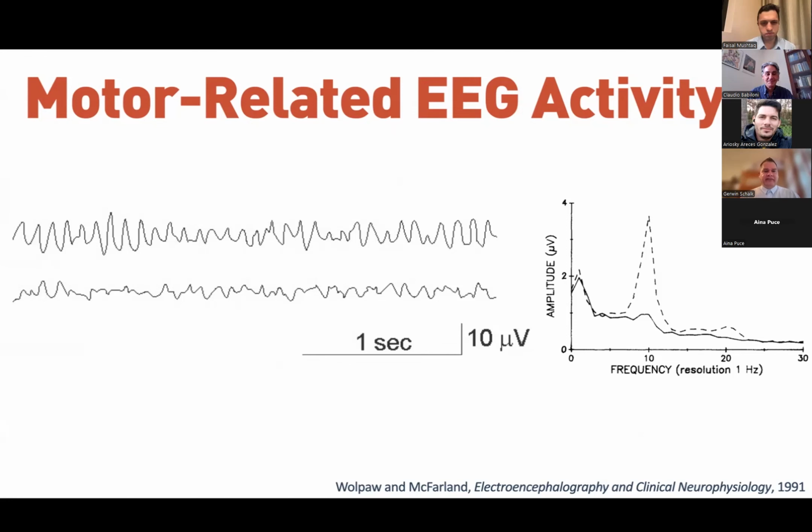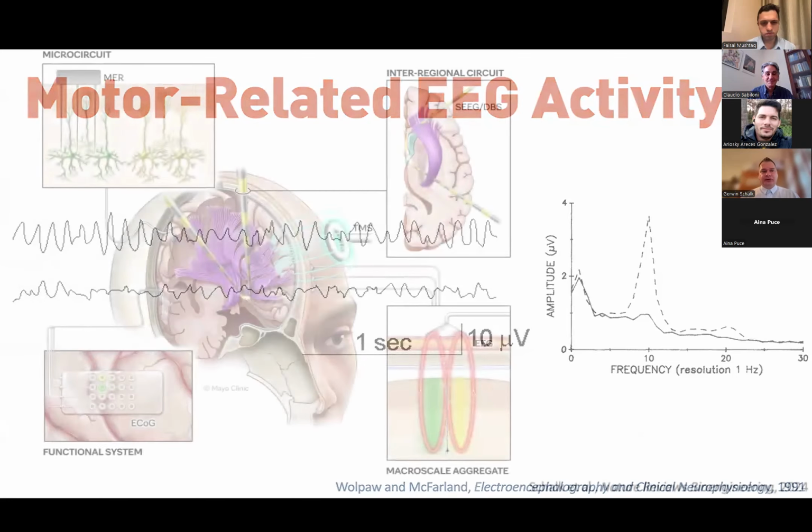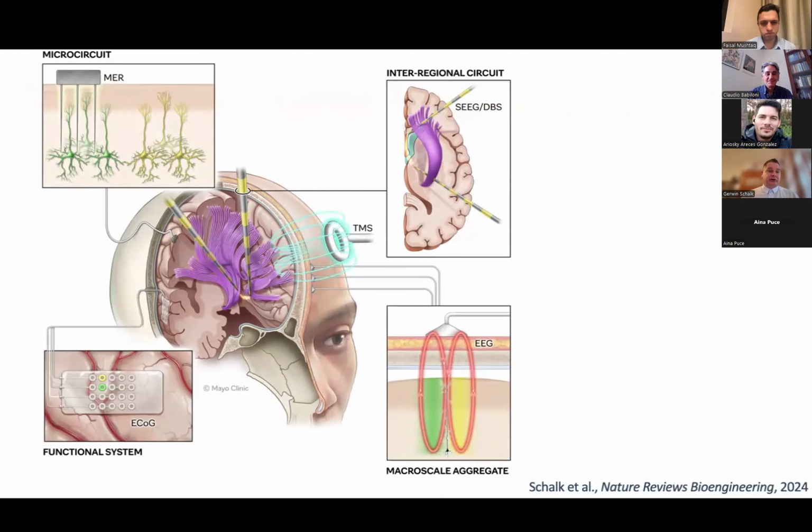Now, a lot of my work has focused on electrocorticography, which is really a beautiful way to see the EEG in more detail. This is obviously something that Hans Berger wasn't able to do, but it's now more commonly possible as part of epilepsy and tumor neurosurgery worldwide.